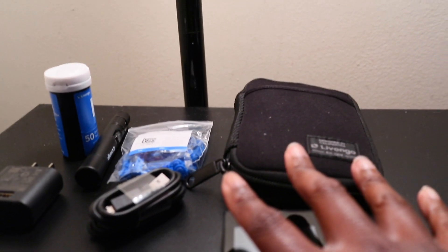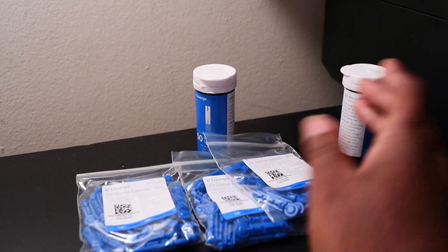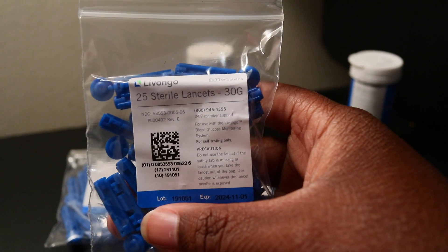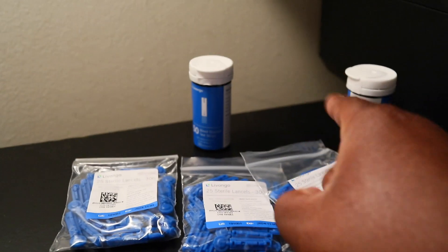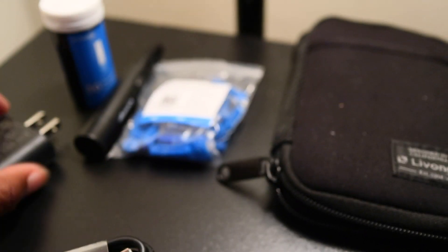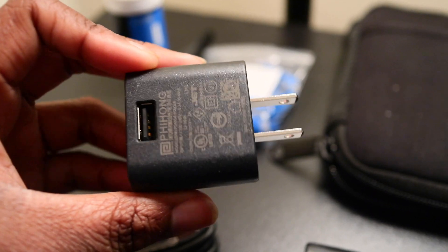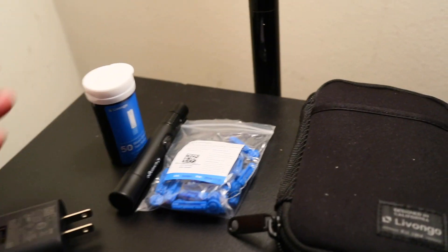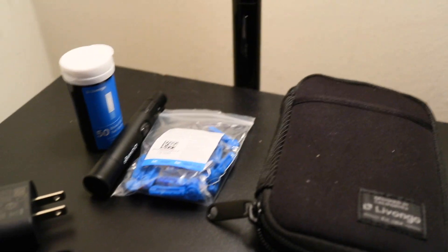I'm going to give you guys an overview of everything that came in the box. This is everything that came on the top of the box, but then you lift up the box and get the starter kit. You get two extra tubes of test strips, 50 a piece, and then you get three extra packs of lancets, 25 a piece — so that's 75 lancets, plus 100 with the starter kit, making 150 total. Then 100 more lancets, and you get this case, this device, a micro USB cable, and a USB wall hub. If you already have a micro USB at home, you can just keep these two things in the bag just in case.